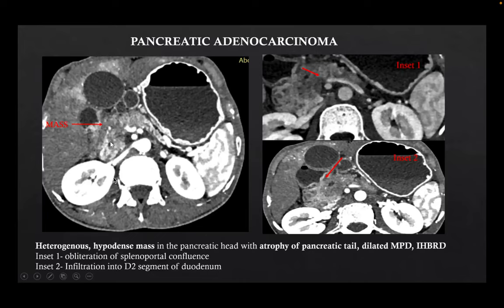This was a case of pancreatic adenocarcinoma. We can see a heterogeneous hypodense mass in the pancreatic head with atrophy of the pancreatic tail, dilated main pancreatic duct (MPD), and intrahepatic biliary radicle (IHBR) dilatation. In insert 1, we can see obliteration of the splenoportal confluence, and in insert 2, we can see infiltration into the D2 segment of the duodenum.